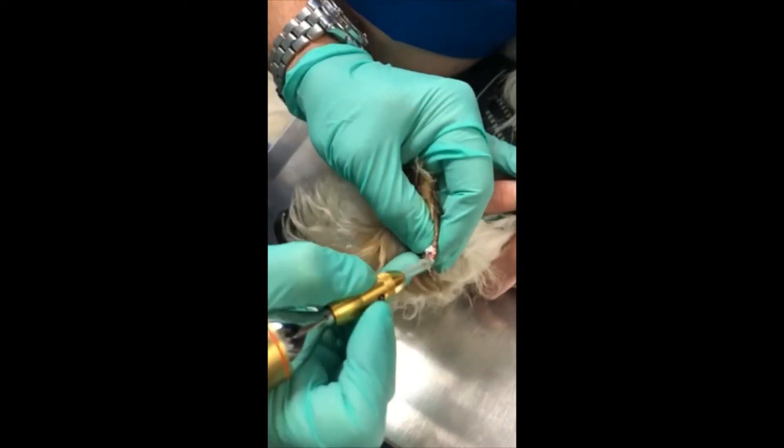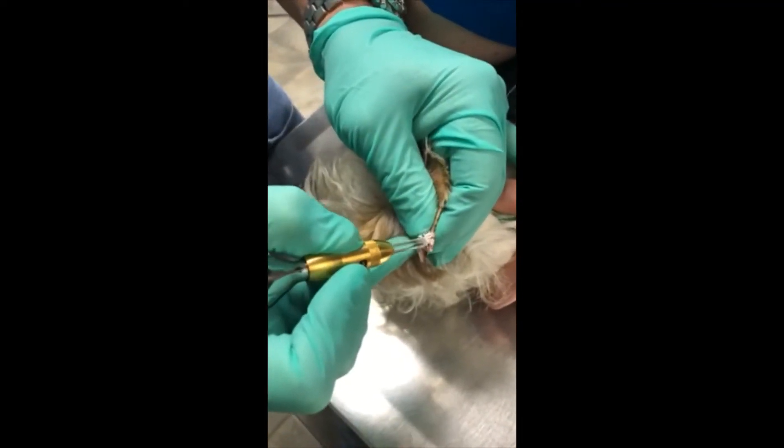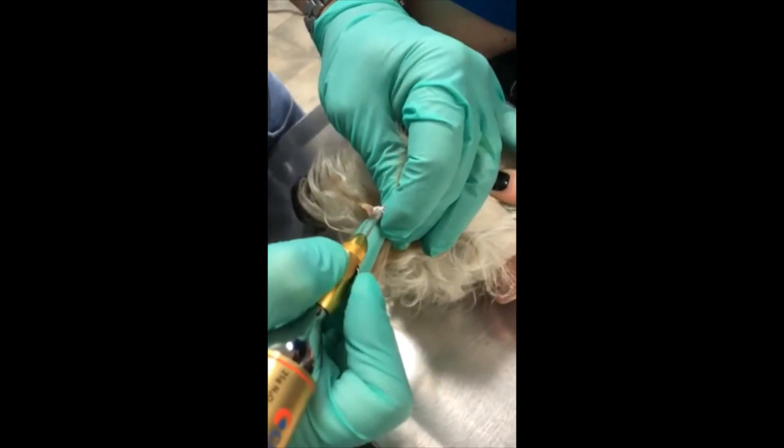By the way, we're trying to make sure that we get contact with the mass, and so we are literally scraping or brushing off the frost as it occurs.